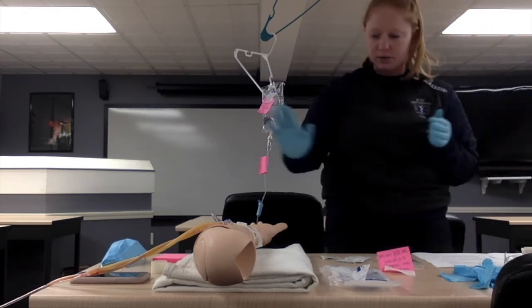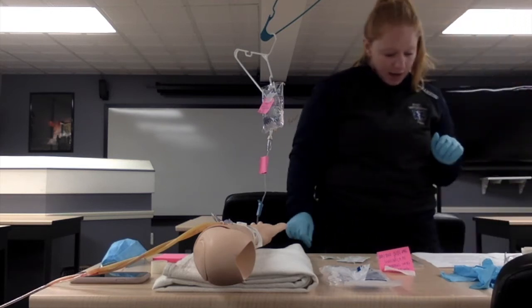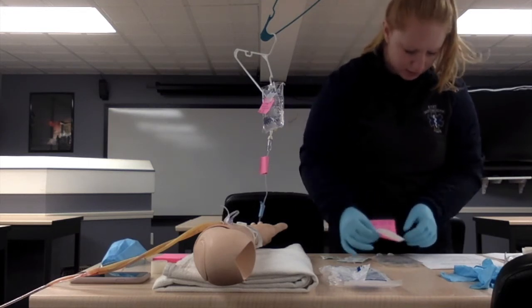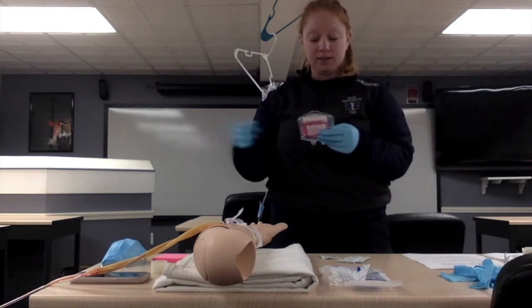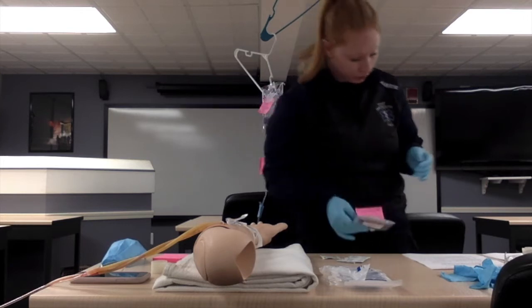So we confirmed our 6 R's, we confirmed our patient, date of birth, name, no allergies, multiple times. We have our provider orders. So now we have all our equipment. We're going to label the infusion with the patient name, date of the infusion, prescribed infusion rate, the time that it began, and completed time. So we have Ellen Davis. We'll have the date of today, my initials. It's 50 mLs. It's a gram of Ancef, and it's going to be a start time of 14:30, so we'll end at 1500 because we'll be over 30 minutes.